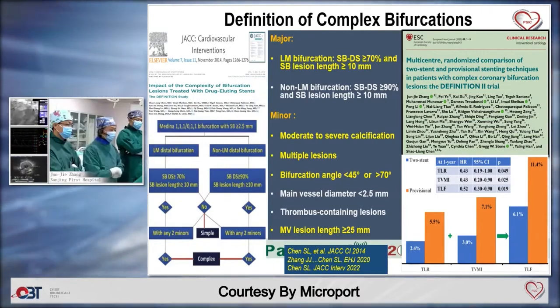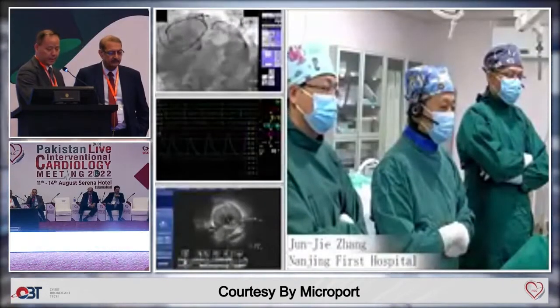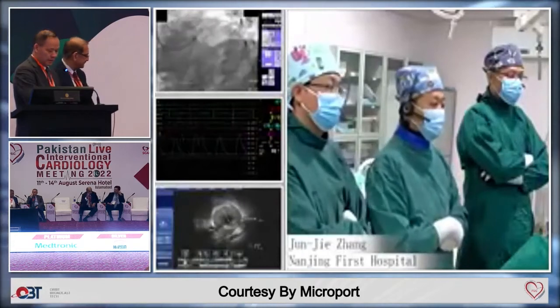So actually from baseline angiography, it looks like a trifurcation distal left main. So also we have a strong panelist. So can I have some comments from panelists?